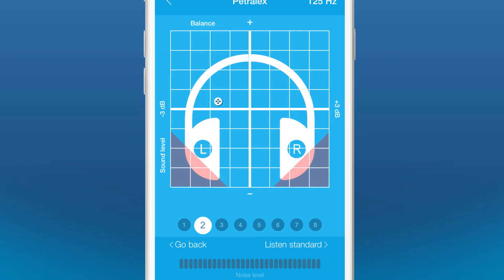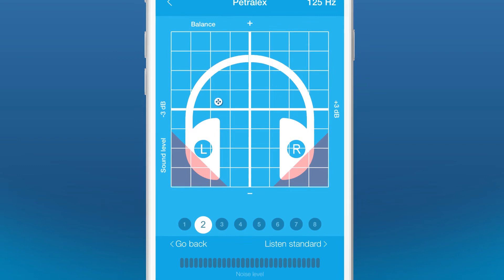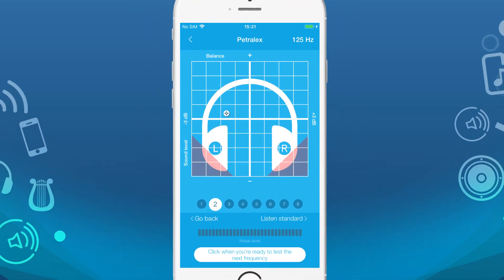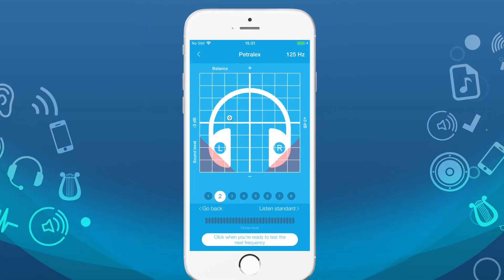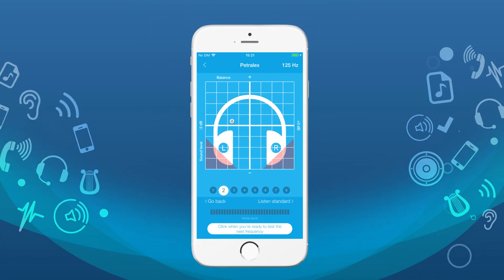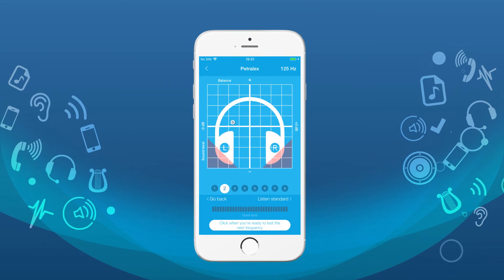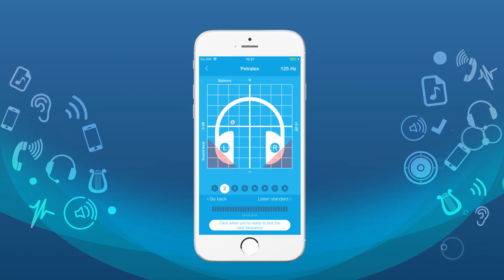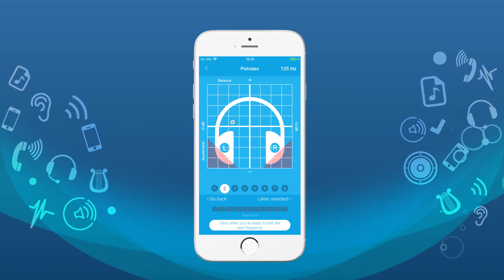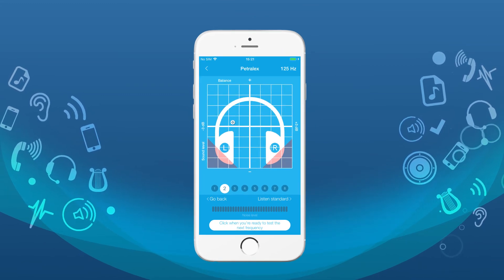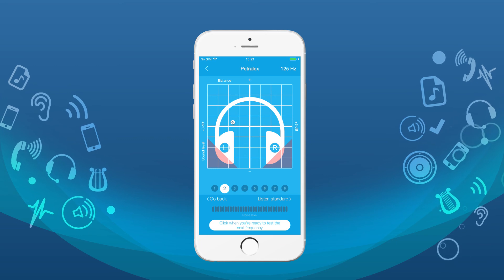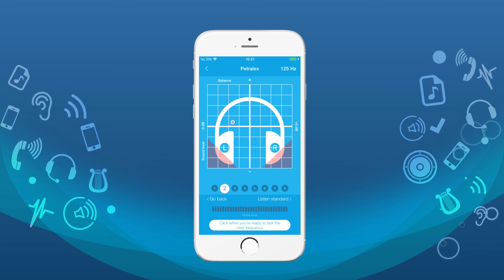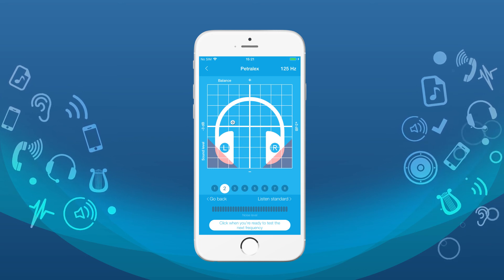After that, go to the next frequency and repeat the adjustments. Use the results of the test for the first frequency as the standard for the adjustment of subjective volume for the following frequencies.